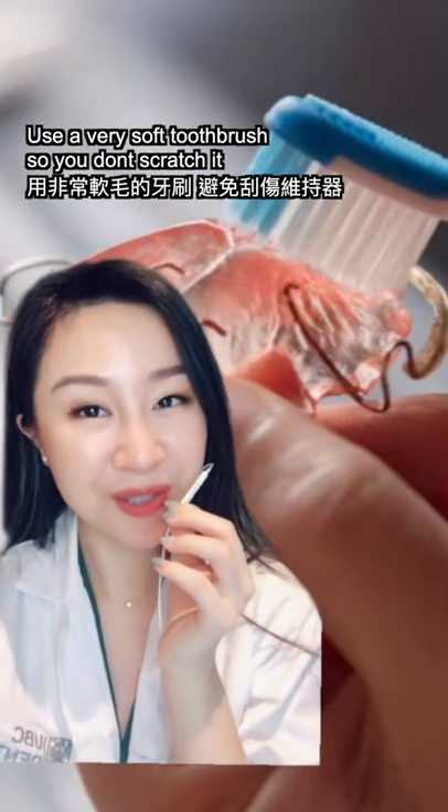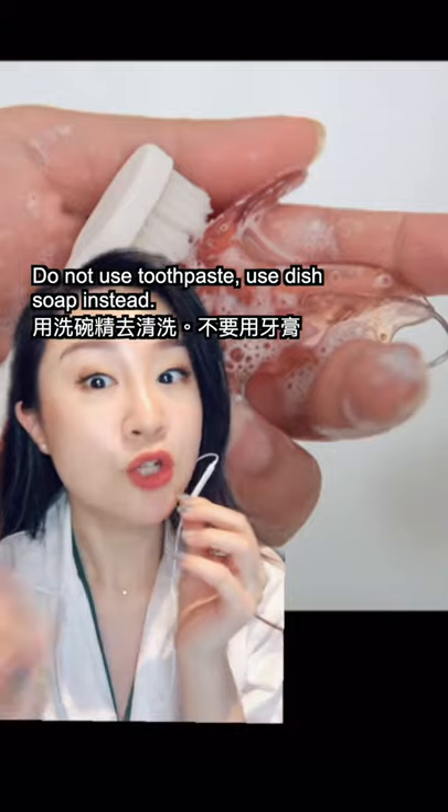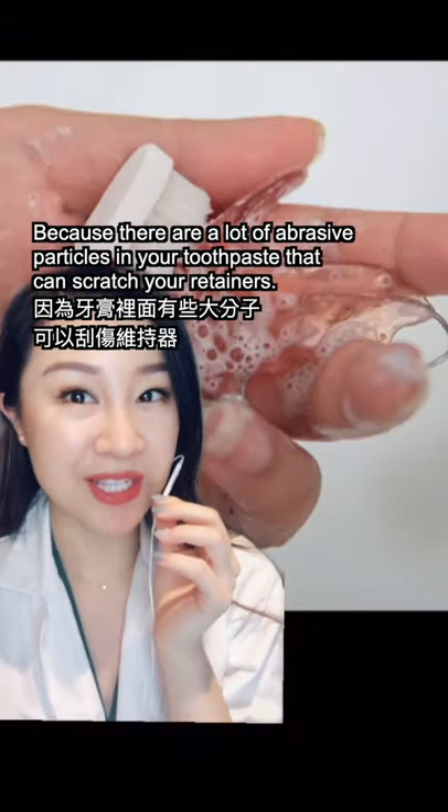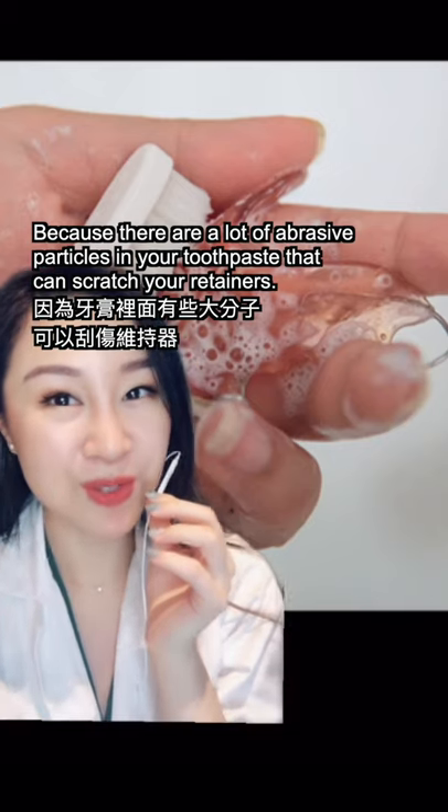Use a very soft toothbrush to clean your retainer so you don't scratch it. Do not use toothpaste — use dish soap instead, because there are a lot of abrasive particles in toothpaste that can also scratch your retainers.